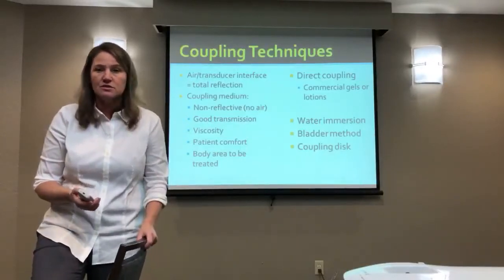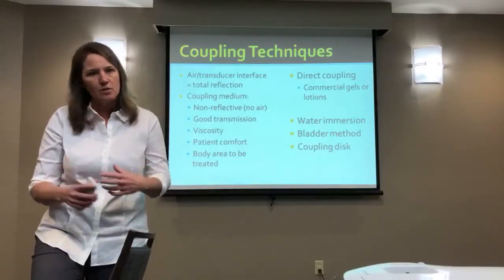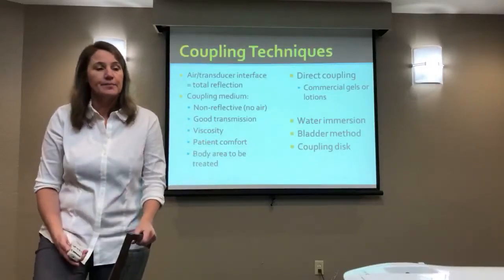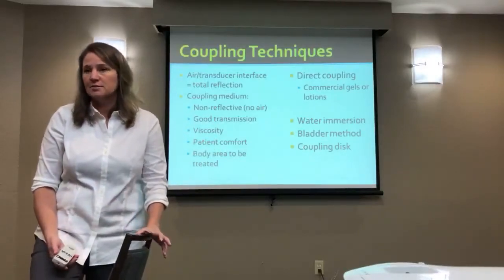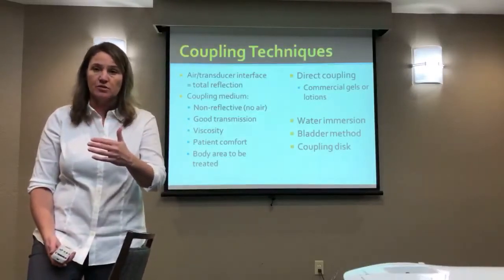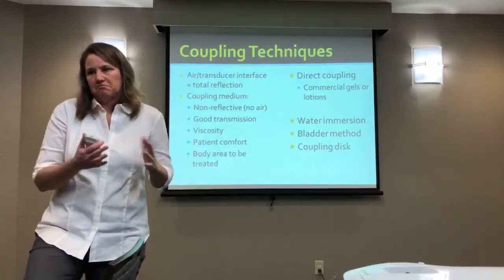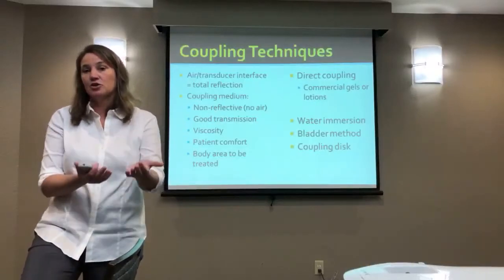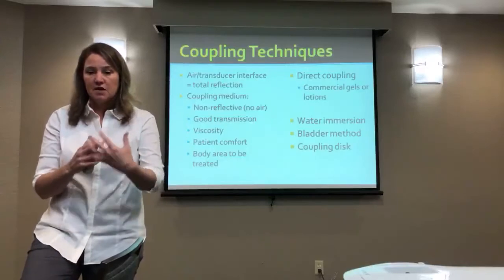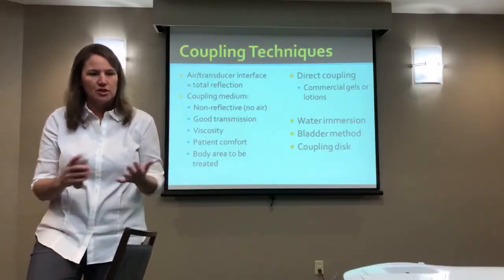They do make lotions that might be a better medium if you're going to follow up with massage. So what you're going to do after might dictate what you use. But whatever you use, it should have good transmission. You can always call your manufacturer or look at what it says you can and cannot use with the ultrasound. But typically you want to think about not only protecting your machine, but is there something that I could use that could harm the patient, that might alter their sensation or drive a chemical into their body that could be harmful. So it should have good transmission.